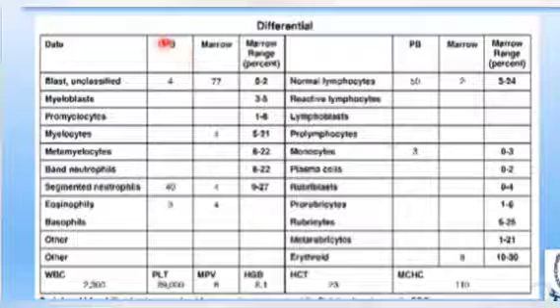It's the count for peripheral blood, and it's the count for bone marrow. Sometimes we miss, or it's unknown, or it's complicated to diagnose disease on the basis of a peripheral blood smear. Then you are going to require bone marrow aspirate or bone marrow trephine biopsy.